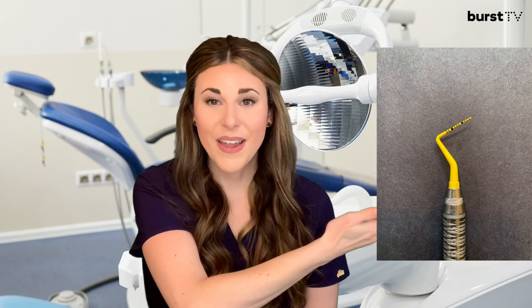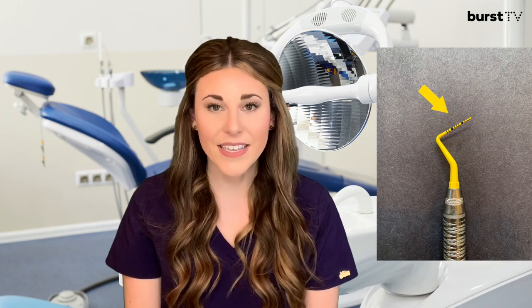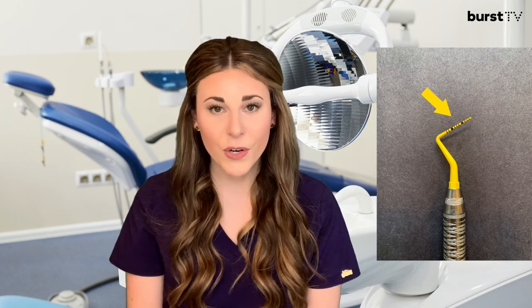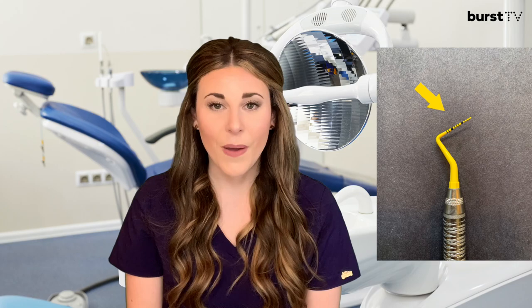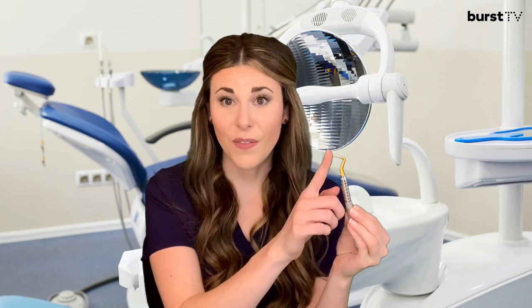The periodontal probe may be a little bit more difficult to see, so let's insert a close-up picture here. You may notice that the periodontal probe has millimeter markings on it. That's because this instrument is a small measuring device used to evaluate the bone levels and tissue health surrounding each tooth. The probe may look like a pokey instrument, but really it's rounded on the end, so if your tissues are healthy, there should be no discomfort when this assessment is being performed.